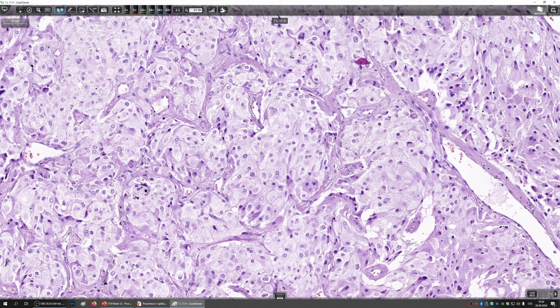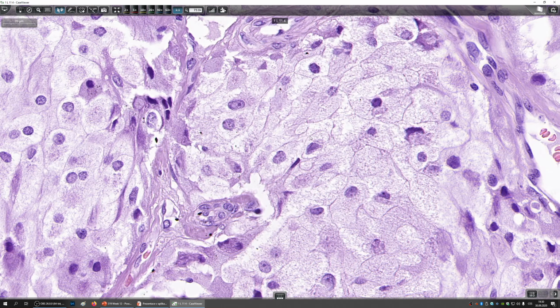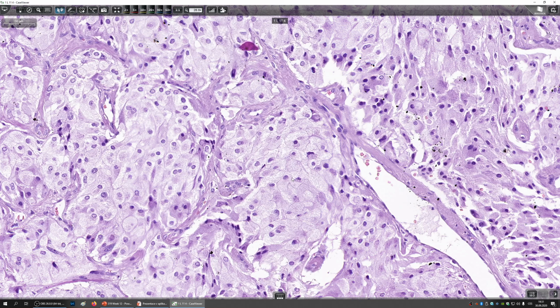But one thing that you can't really see is that in reality there's a dual population of cells. There's the immediately obvious population of the big secretory cells, but you also have a smaller population of the so-called sustentacular cells. These stain with S100. I have a nice picture of S100 immunohistochemistry in my companion lecture. Feel free to check it out. So once again, recapitulation: rather monomorphic tumor cells arranged into balls of cells or Zellballen. They have granular cytoplasm and relatively uniform nuclei with salt and pepper type of chromatin.